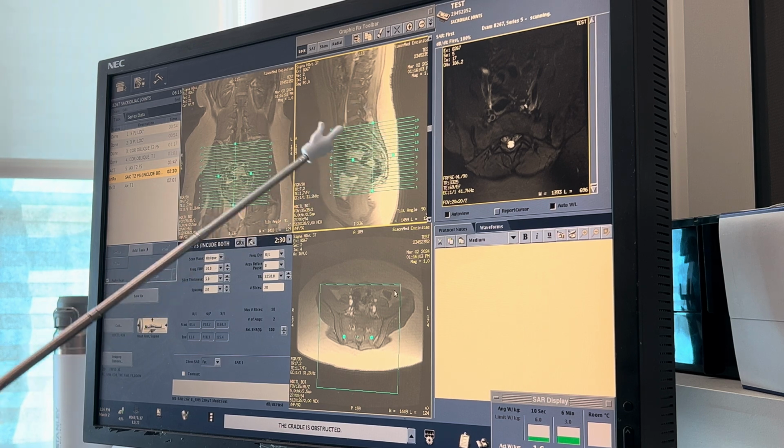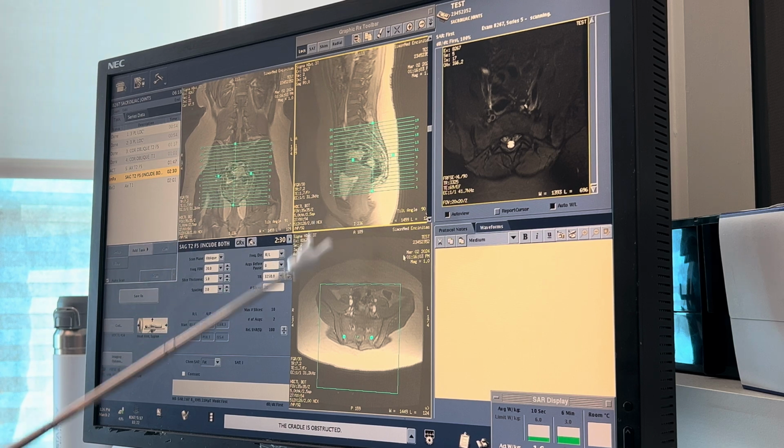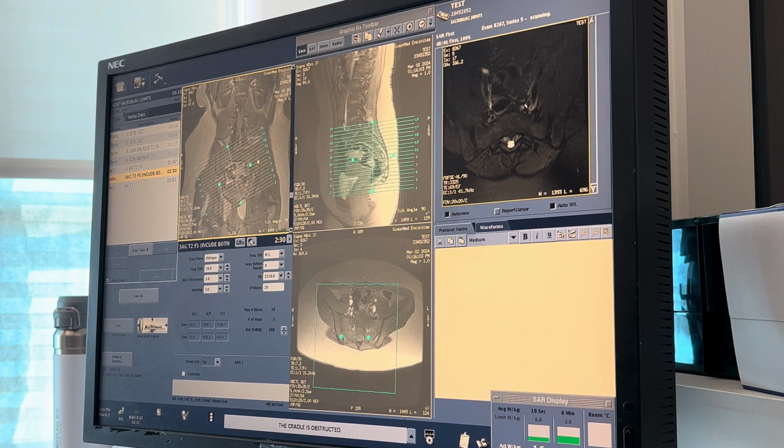Over here in the sagittal plane, we have anterior, posterior, superior, and inferior. Over here, we have anterior, posterior, left, and right, but we can't angle the slices here. We'd just be rotating the FOV. So over here, we have superior, inferior, left, and right. So we're going to have to angle the slices vertically in this plane. That way they're facing left and right.